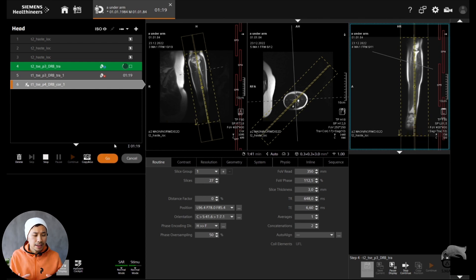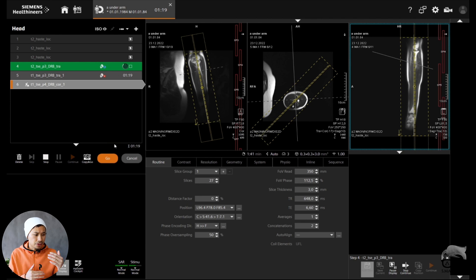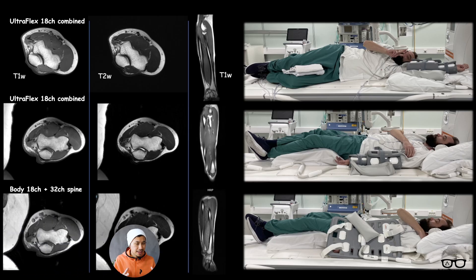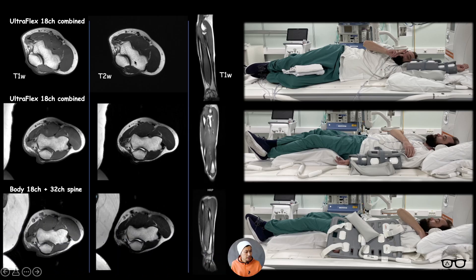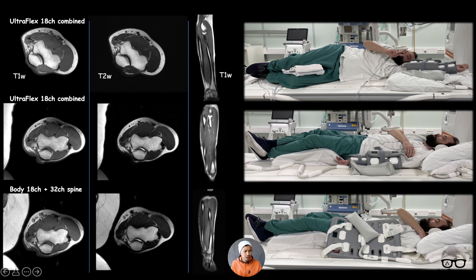As you can see, the coronal is covering a large field of view, trying to cover the whole underarm. And here are some results — T1, T2, and coronal — shown in three different rows corresponding to three different patient positions.